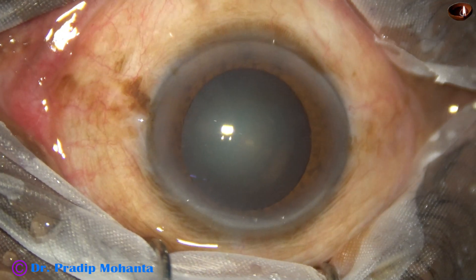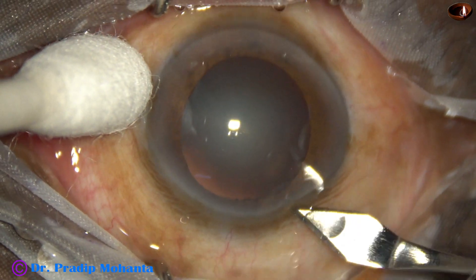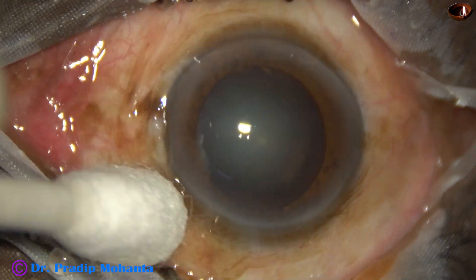The ocular surface is thoroughly irrigated with BSS. This is the main incision with a 2.8 millimeter steel keratome.